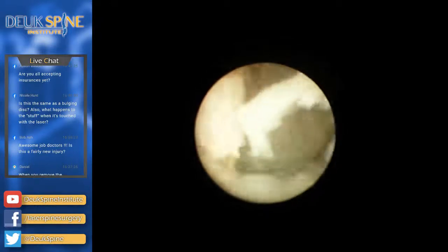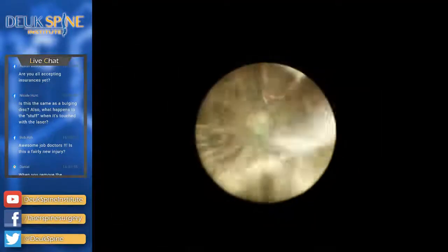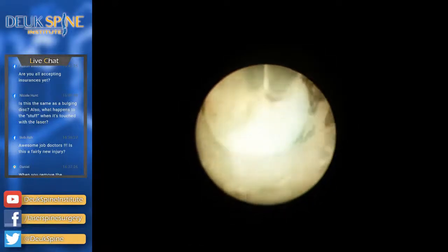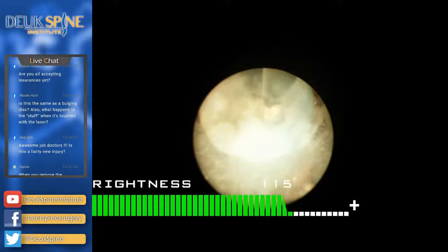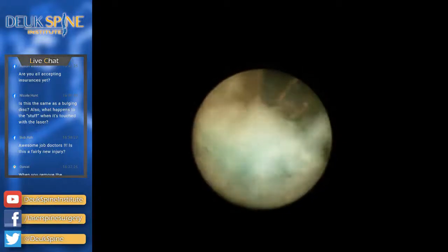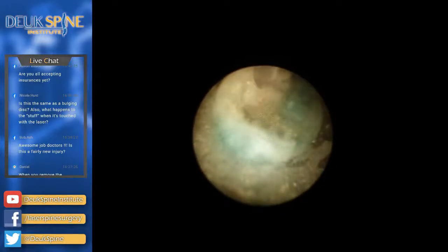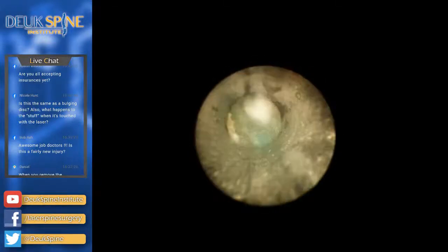Sure. A viewer on Facebook is wondering, is this a fairly new injury that we're looking at or something older? Oh, it's a good question. So, from the looks of things, it looks relatively new. I think the brightness is too high. Take the brightness down. Yeah, nice. This part right here that I'm working on, where it's very scarred up, is older, at least maybe a few years old. But the part that has the fluffy disc material, that stuff is newer.